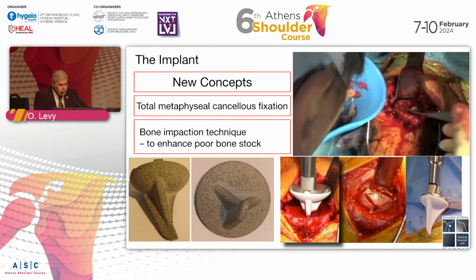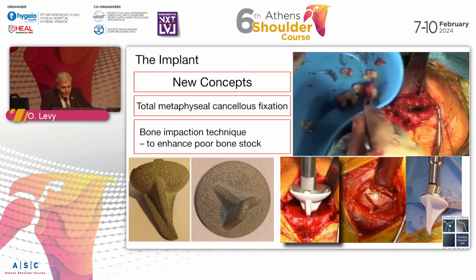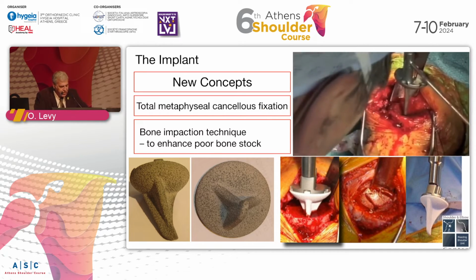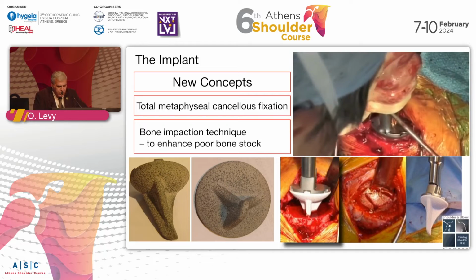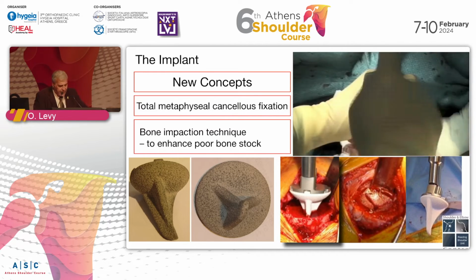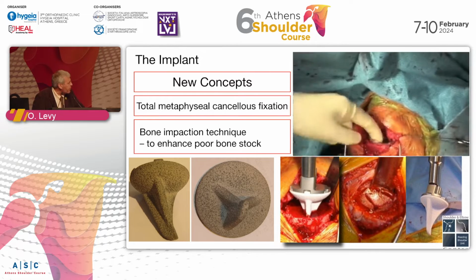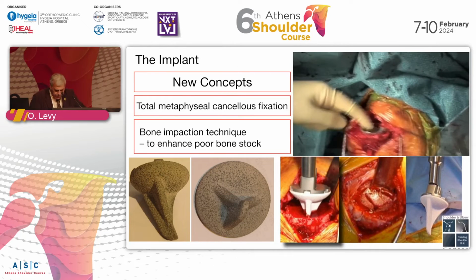There are a few new concepts that we introduced. One of them is the total metaphyseal cancellous fixation, and using a bone impaction technique to enhance the bone stock. And we use the bone from the head, and we impact it, and then we have no problem to impact it even in osteoporotic bone.